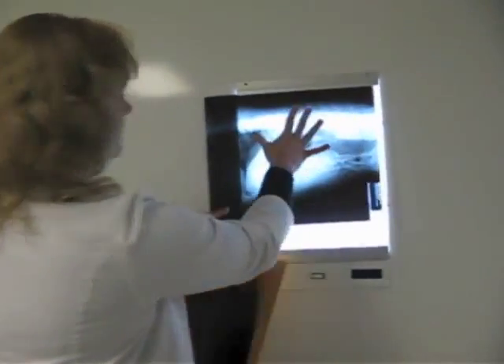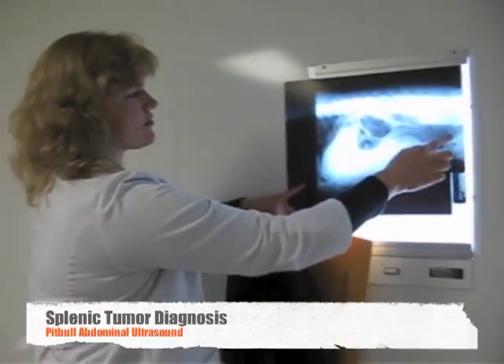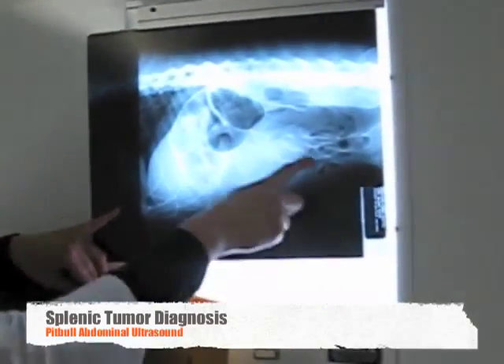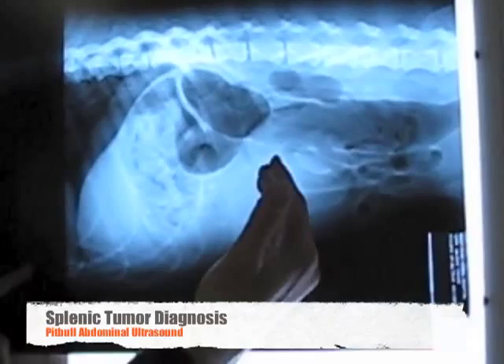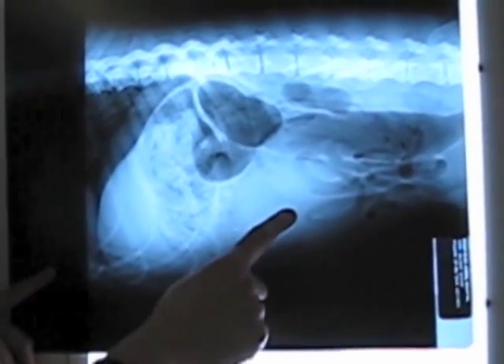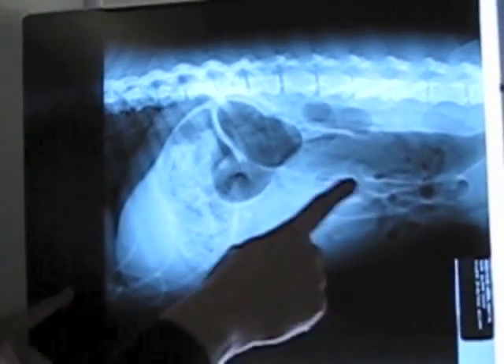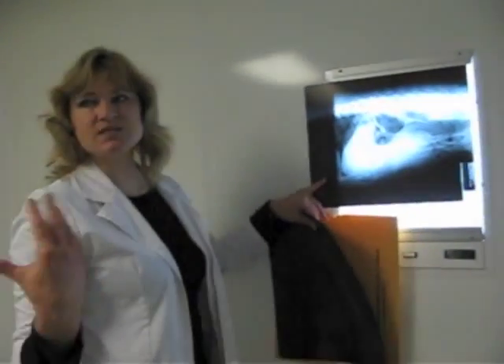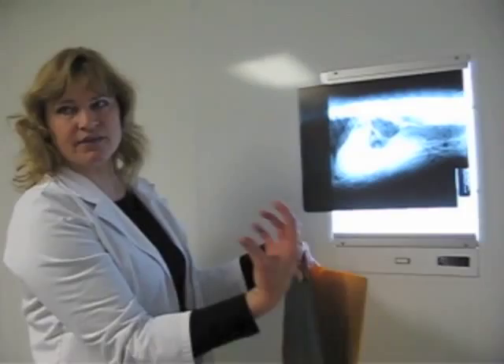This was him laying on his side. We were taking this because this is all kind of just gas, so he pretty much had diarrhea here. That's an empty colon. But right here, it's not very big, but there's just kind of this area where the intestines are pushed back. This triangular portion here is the normal part of the spleen, but then right here we just kind of have this round thing sitting in here. We can't say yet it's a splenic tumor without doing the ultrasound — it's just what we suspect because I can feel a mass in there when I feel him.